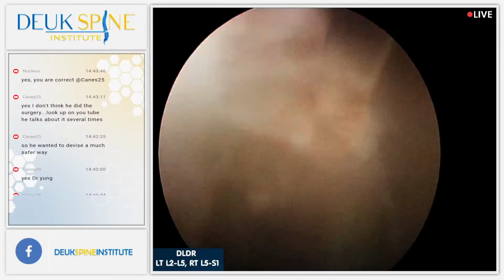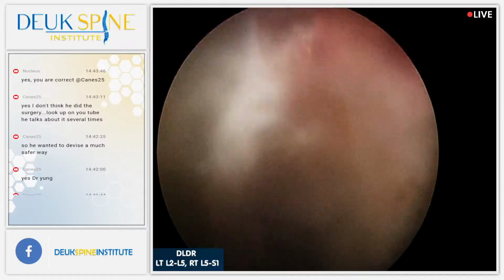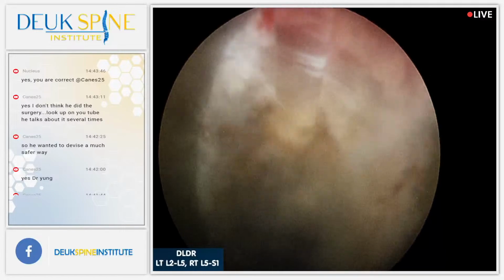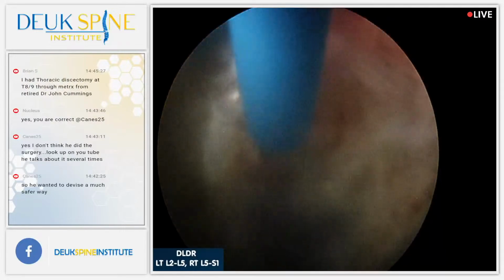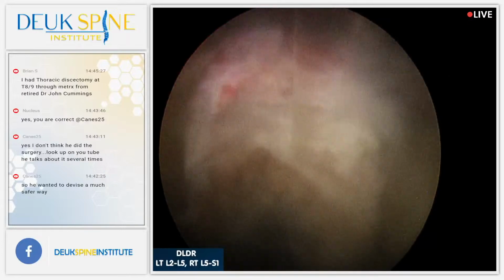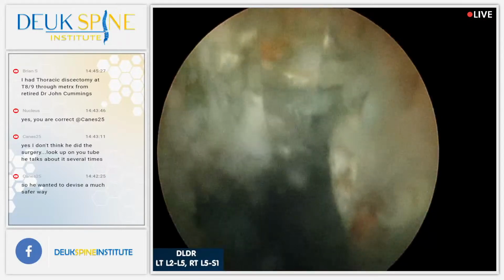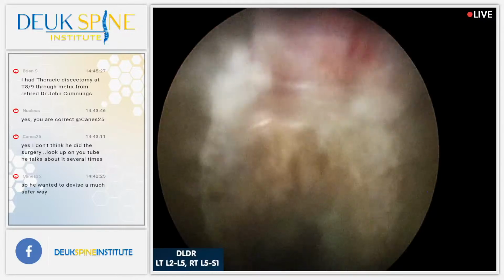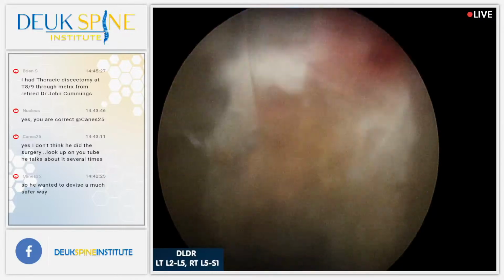Sorry. Did you ask me something, Berndes? No. Henry, any more questions? Yes, we have a question from the name goes by SHS. And their question is, so did you get through or around abnormal bone?